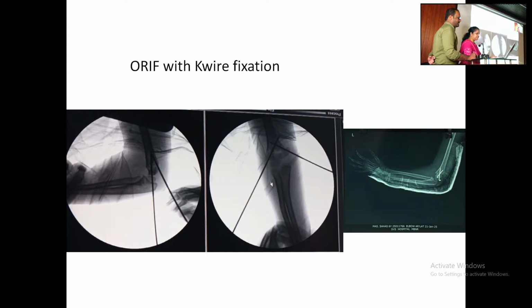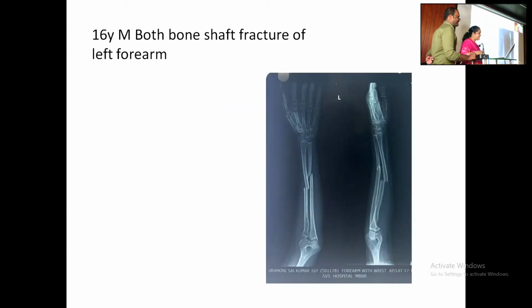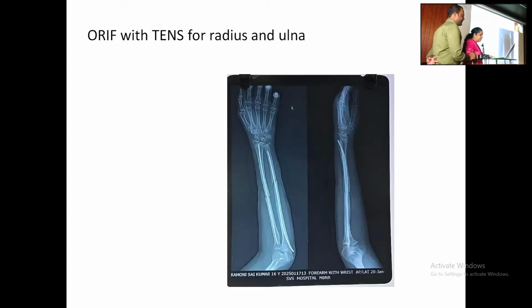Okay, sir. Go ahead, sir. This is a 16-year-old male with both bone shaft fracture of the left forearm, sir. We have done open reduction and internal fixation.